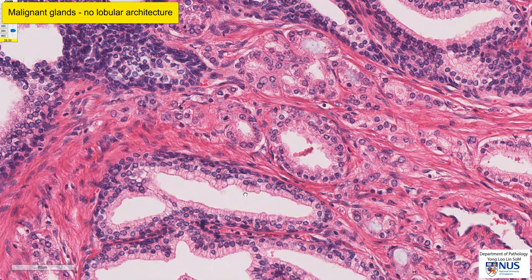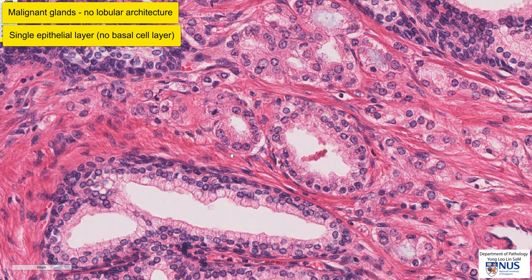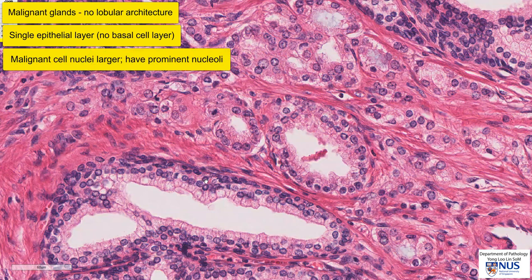If we do a side-by-side comparison, we will first notice that the malignant glands only have a single layer of epithelium. Secondly, the nuclei in the malignant glands are larger than those in the benign glands. And thirdly, the malignant cell nuclei also exhibit prominent nucleoli. We don't see them in every single cell because it depends on the plane of cutting of the nucleus, and we don't see these prominent nucleoli in the benign cell nuclei.